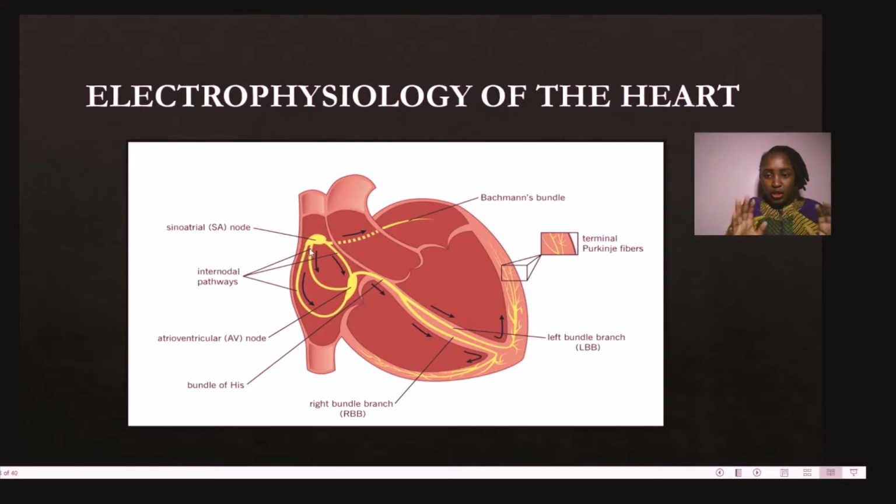So anything that is within the normal range, the normal rhythm, will have a term, sinus. The normal sinus rhythm means it is coming from the sinus, the sinoatrial node. So that is where that term comes from. Then you can also have sinus bradycardia and sinus tachycardia. So yes, the impulses are being generated by the sinoatrial node, and the communication is happening, but then something is lost somewhere in translation in the process, creating either a bradycardia or a tachycardia. So bradycardia is when the heart rate is below 60 beats per minute, while tachycardia is when the heart rate is above 100 beats per minute.